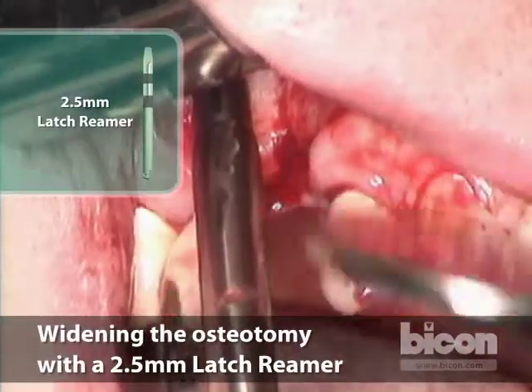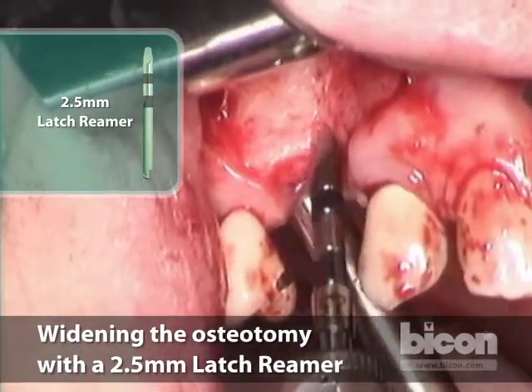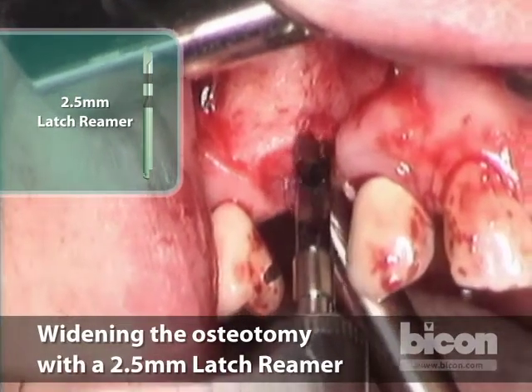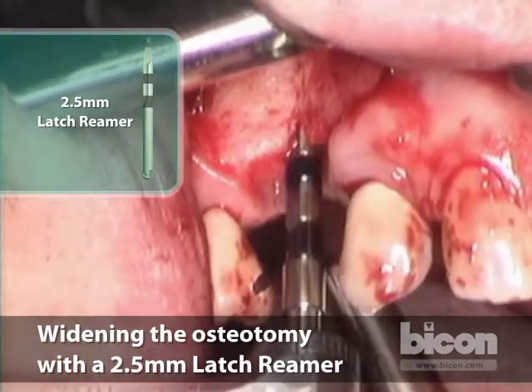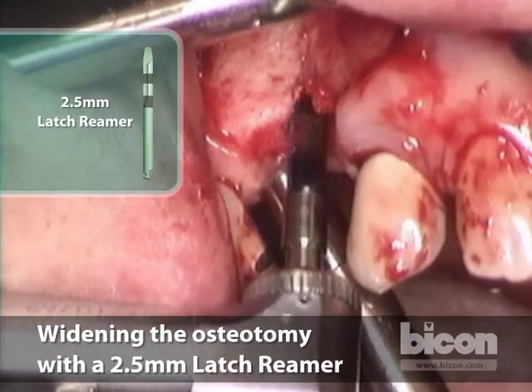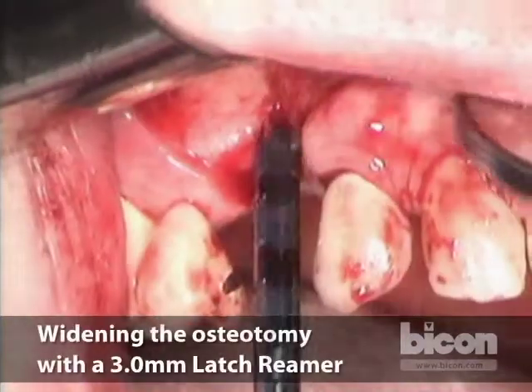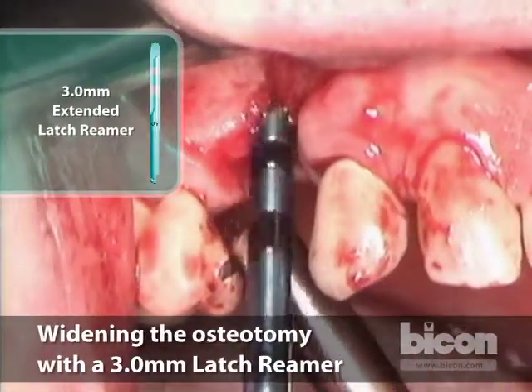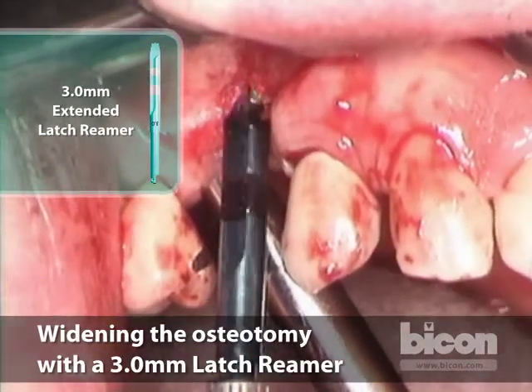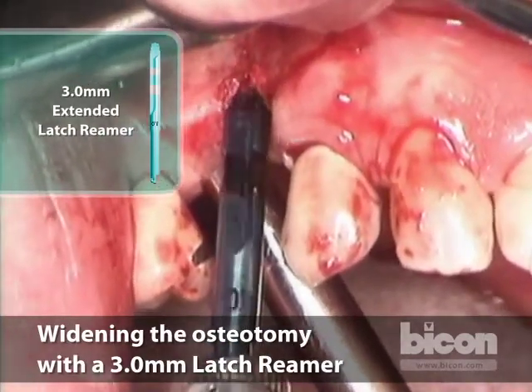Now we will switch to a much slower speed, and that will be under 50 RPM, and we go with the reamers. This is a 2.5 millimeter reamer. And let me take the medium length ones, please, from now on. Suction, good. As you see, the buccal plate is pretty thin. It's almost translucent, and we are seeing it now.